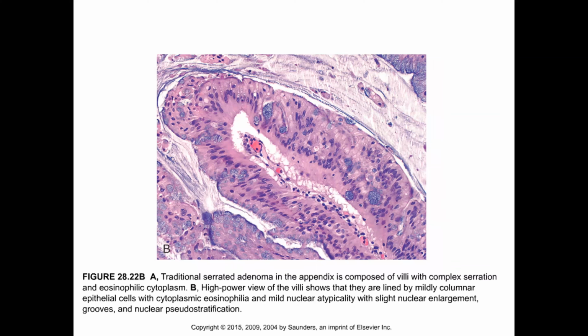Traditional serrated adenoma, you'd like to see the microcrypts and villous architecture. This has a little degree of dysplasia, but does not really demonstrate well the microcrypts or ectopic crypts that are characteristic of traditional serrated adenoma.